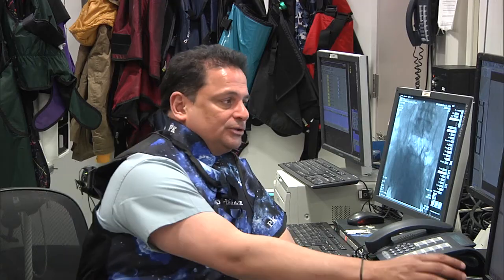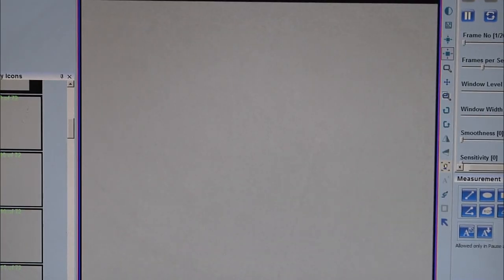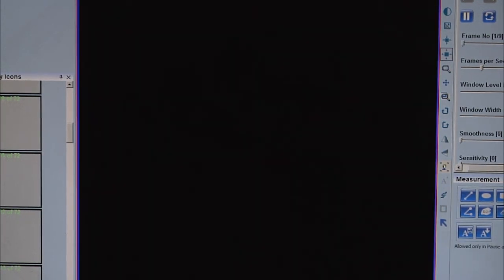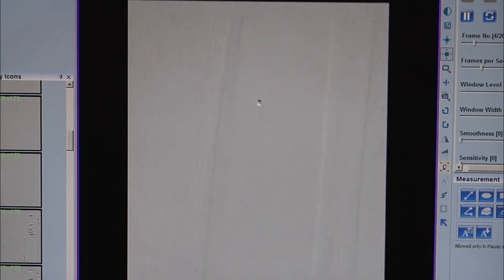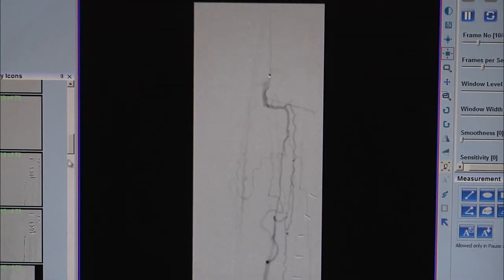So how we did it was, we actually took the needle. We had to bend the needle because of the difficulty of the fibrosis of the site, because the patient had an operation here with a bypass graft and anastomosis. So with great amounts of difficulty, I'm going to show you here, this is us trying multiple different views. And here you can see you have 3 wires here. With great amount of difficulty, we were able to get into the vessel.